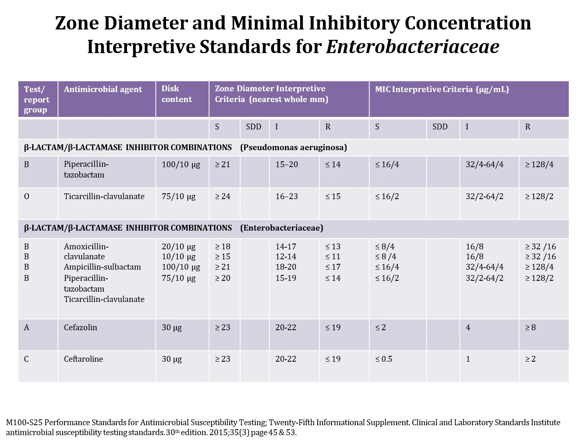So depending on the breakpoint, the MICs are interpreted as sensitive, intermediate, or resistant. Hence, the clinicians should be supplied with the breakpoints in the microbiology reports so as to guide them with the interpretation of the MICs.